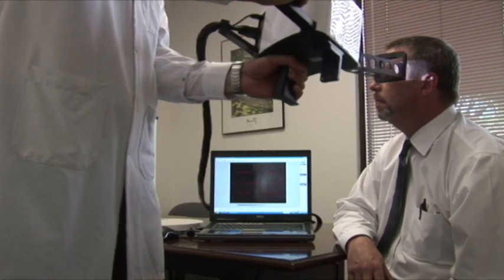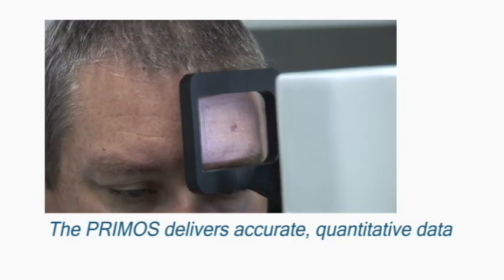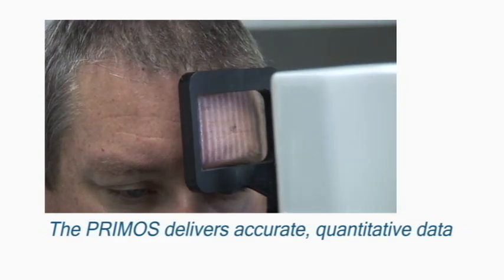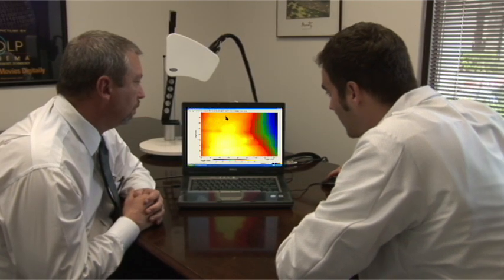Doctors, patients, and researchers have been searching for a way to obtain accurate, quantitative data on the effectiveness of various products and procedures. Reliance on subjective visual analysis has been the norm in the past. Going far beyond the simple visual analysis, the Primos delivers precise measurements of skin contour characteristics.